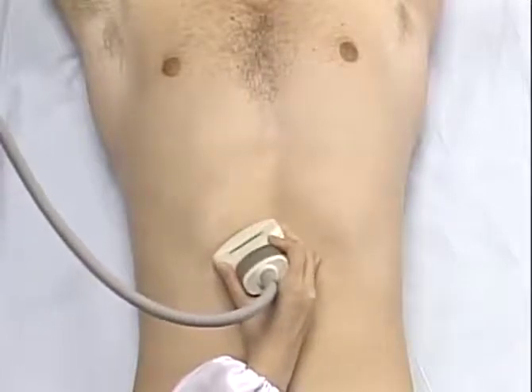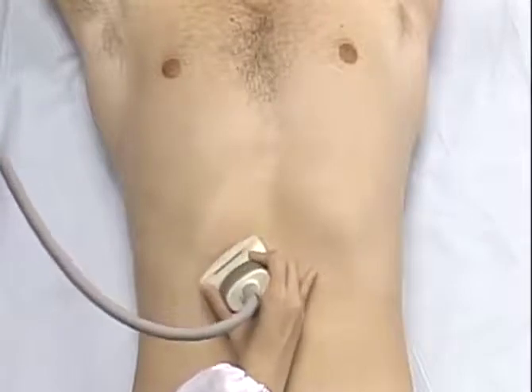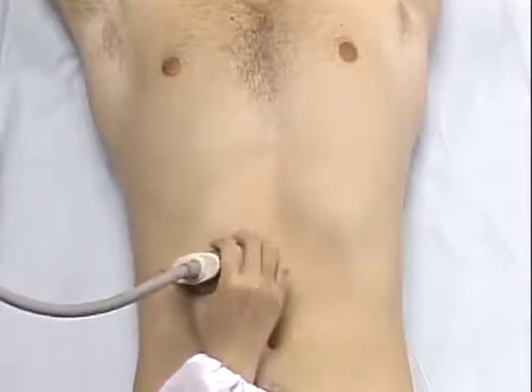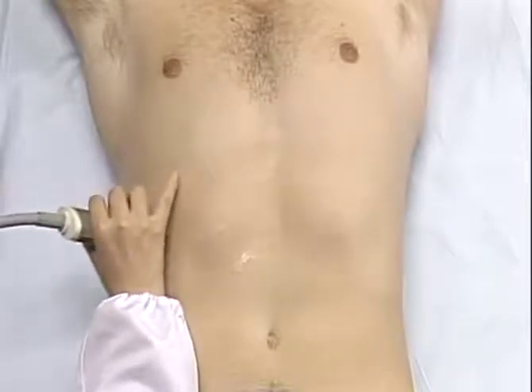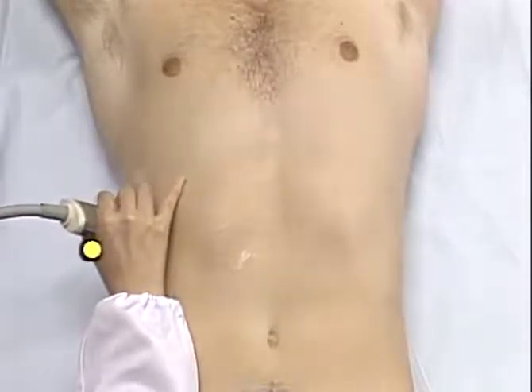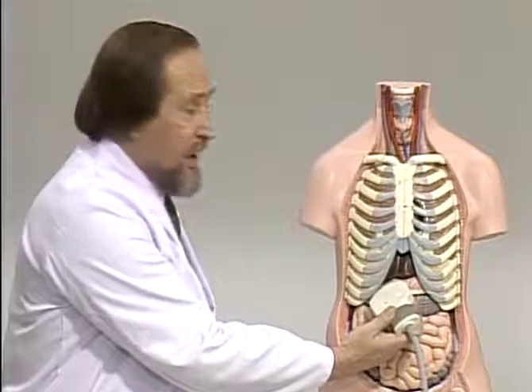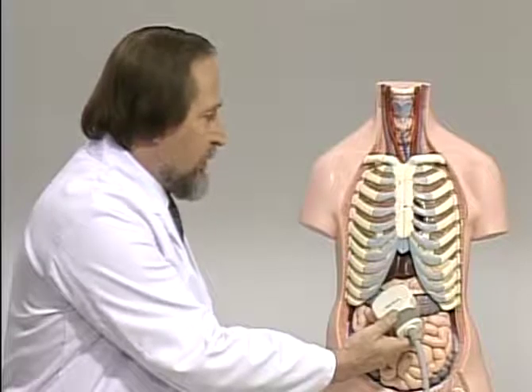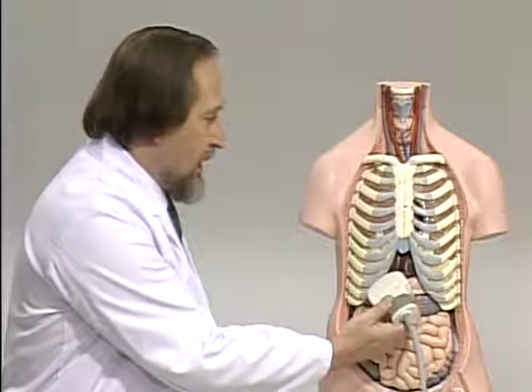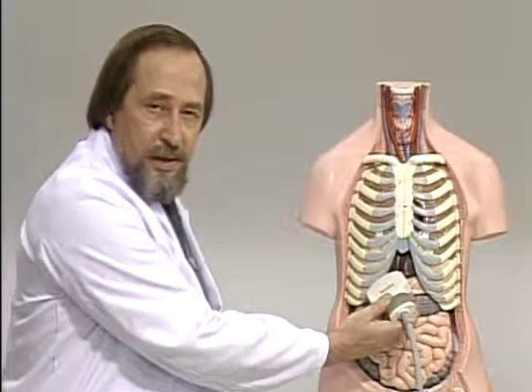In an obese patient or a patient with a large amount of intestinal gas, this procedure may fail to detect the gallbladder. In this case, use the right intercostal scanning technique and scan the intercostal space between the 6th and 7th ribs, 1 or 2 ribs above the normal scan. That is to say, in a lean patient, the gallbladder is located lower than normally, while that of an obese patient is located higher. Bear this in mind, and you'll be able to detect the gallbladder rather quickly.